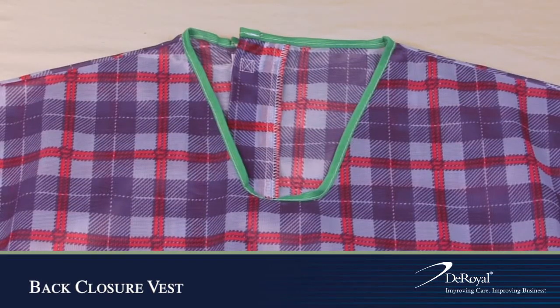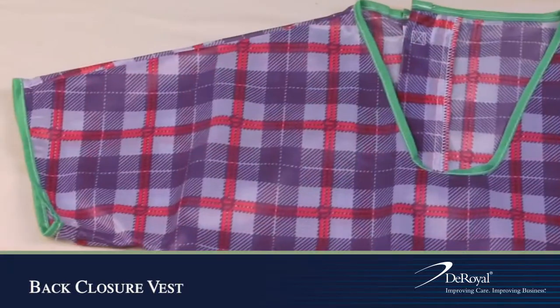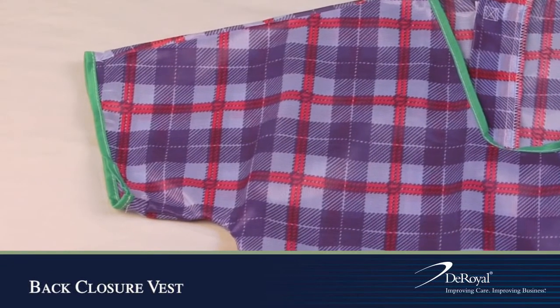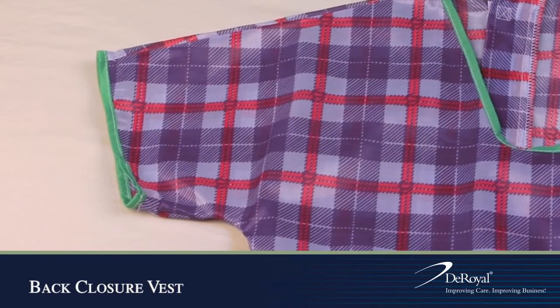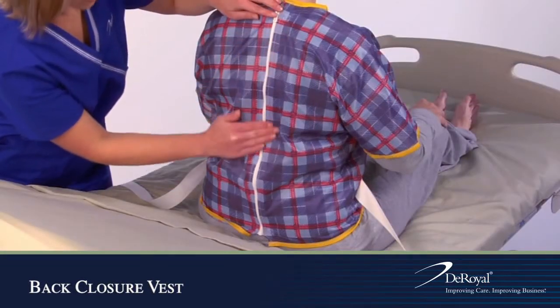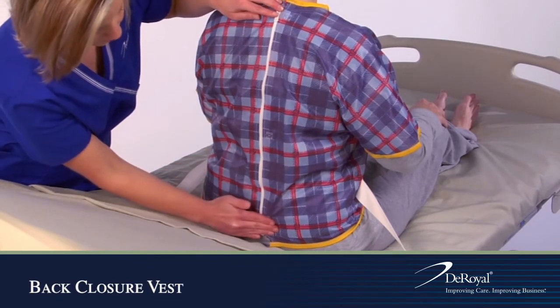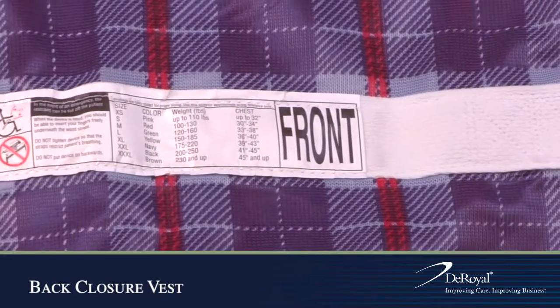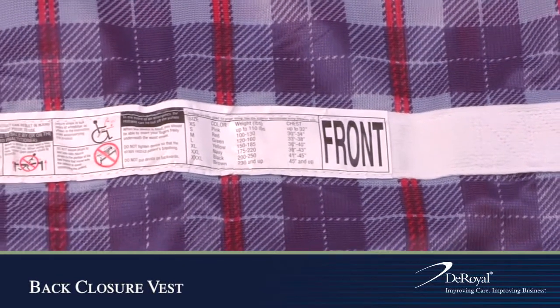The low neckline enhances patient comfort and safety. The longer sleeve design helps prevent patients from working their arms out of the vest. The offset zipper back closure helps prevent pressure on the spine. The front waistband is clearly marked with 'front' to ensure proper application.